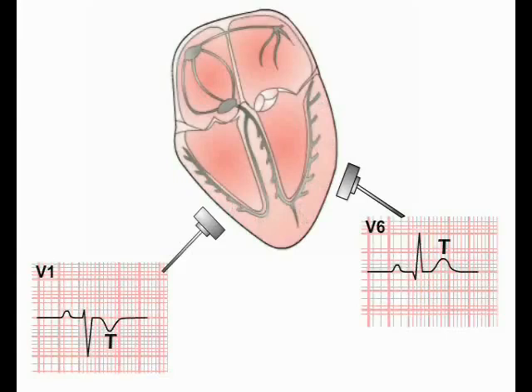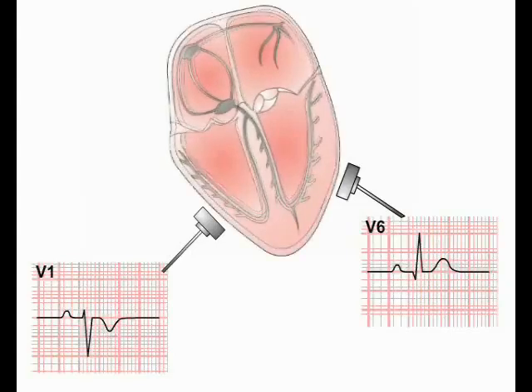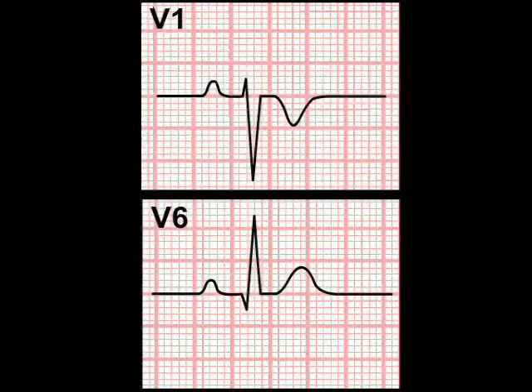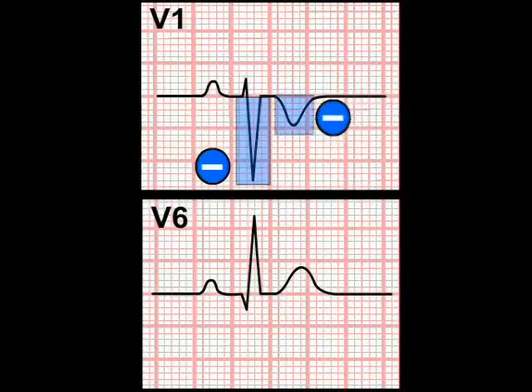Cardiac repolarization spreads relatively slowly through the muscle mass outside the conducting system. Hence, the T wave is considerably longer in duration and therefore broader on the ECG paper compared to the QRS complex. You should also realize at this point that the fact that repolarizing current moves through the ventricles in the opposite direction to the depolarization wave means that in leads with an overall negative QRS complex, that is, the negative deflection is larger than the positive deflection, the T wave also tends to be negative, lying below the isoelectric line.